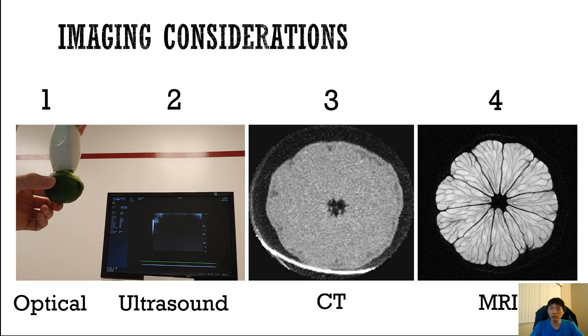So it's quite a quick modality where you put the patient on the table, you send the patient through. There's not a whole lot of parameters to change. It's more or less kind of a push button type of technique. So it's kind of a one size fits all, same imaging parameters for every patient.